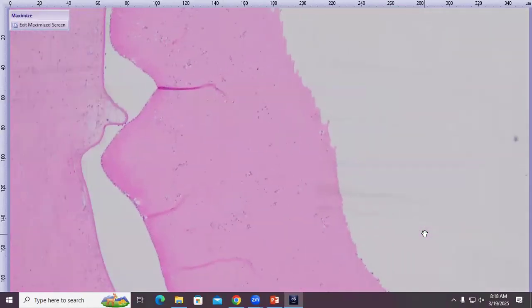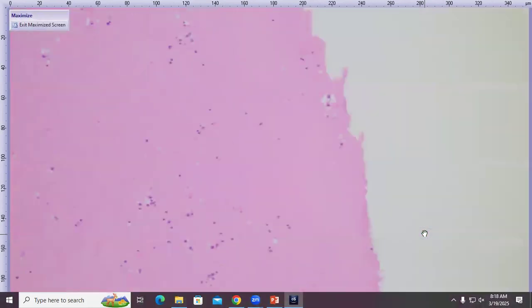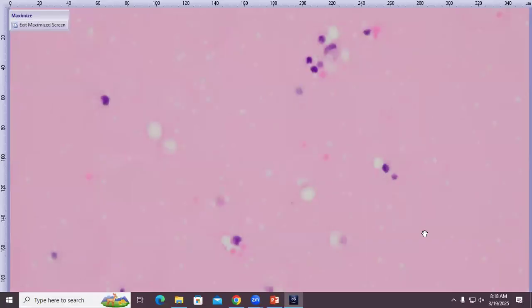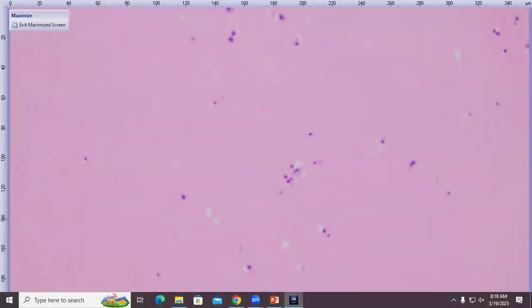So as we move back into the eye, here's that high proteinaceous exudate. And when we look at higher mag, it's just sort of homogeneous to slightly vacuolated. And then the cell population that is floating around here is macrophages. This guy's a macrophage. We've got some red blood cells, and we've got some mononuclear cells. This might be a neutrophil. So we've got sort of a mixed bag of inflammatory cells floating around in the ocular chambers.